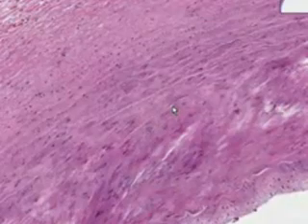cells. In addition, if it is a very large artery, it may have more than just one band of elastic tissue. It may have other elastic fibers in it, like you see the lighter line here and here. But notice that these elastic fibers do not extend the full thickness of the wall as they do in the aorta and the other classical elastic arteries. So this is just a large or medium-sized artery.